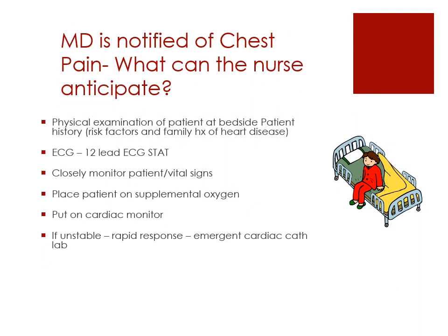Of course, now that you see that your patient has chest pain, you're going to call the MD. The MD, of course, to cover themselves, will order an EKG. The EKG, you can do it yourself. We have portable EKG machines on the unit. You can also page respiratory stat, and they will come and do the EKG for you as well. If they're on a telemetry monitor, call the telemetry person and tell them, hey, can you kindly record this because my patient's in the middle of having chest pain, to see if there's something going on.